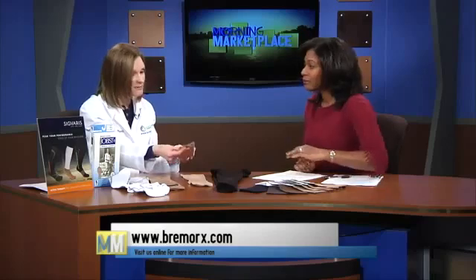Absolutely. So we have a lot of different things here. So when you hear the word compression hose or support hose, you might have a picture in your head of something that's not pretty. So I wanted to kind of erase that picture and show people all the options that they do have. So of course we have the normal knee-high that can come in many different colors and styles. And then you mentioned the open-toed, which I like because some people need to wear compression hose every day, and that can be maybe problematic during the spring and summertime. We want to wear our open-toed shoes. We want to show off our pretty painted toes. So here we have that option where you can easily still wear your compression garments and wear your sandals.